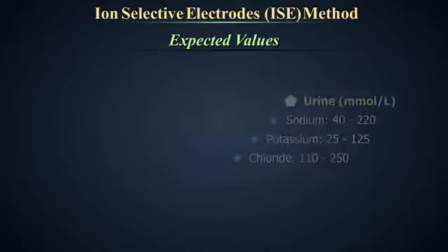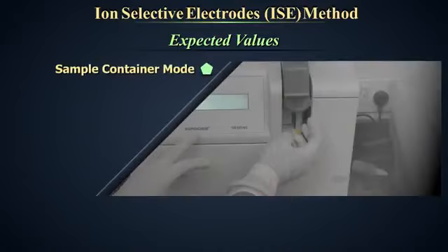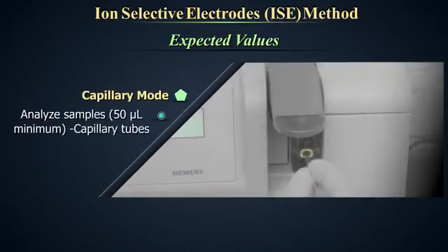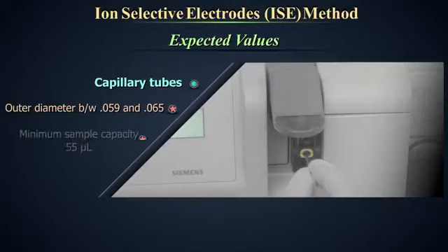In this instrument, samples can be run in 2 different modes. Sample container mode is to analyze samples from collection tubes, sample cups, or syringes. Capillary mode to analyze samples from capillary tubes. Capillary tubes must have an outer diameter between 0.059 and 0.065 and a minimum sample capacity of 55 microliters.